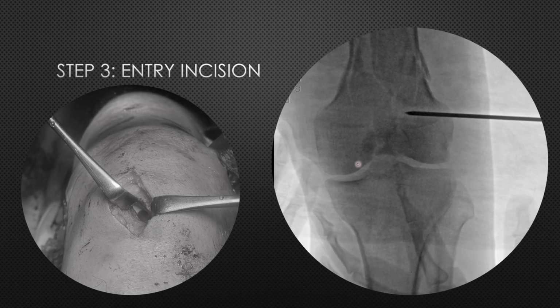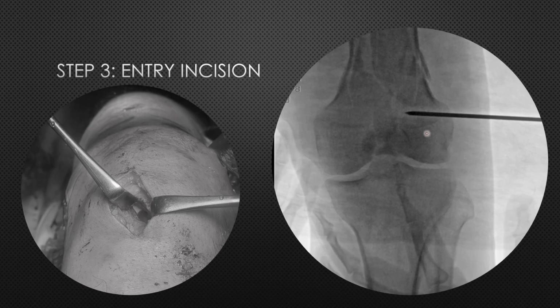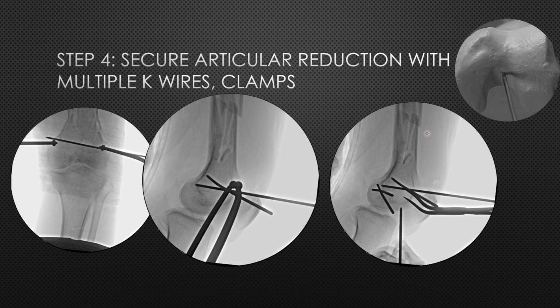So here the fracture was a simple one, and what we did, we made an entry here by slitting the patellar tendon, and you see my finger is there and I am able to palpate the terminal part of the trochlea, and also I will be able to feel whether there is any articular step or not. Minor articular steps can be corrected by simply positioning of the clamps in anterior or posterior direction. Usually the condyles tend to have anterior opening, and by using a clamp anteriorly we'll be able to compress that opening. Like here also you see we have tried to compress the condyles using a clamp.